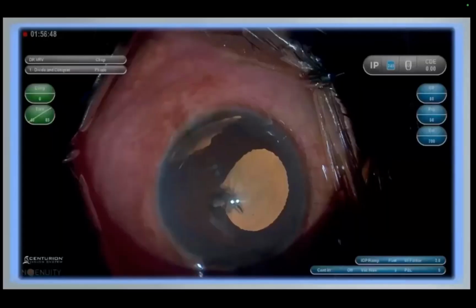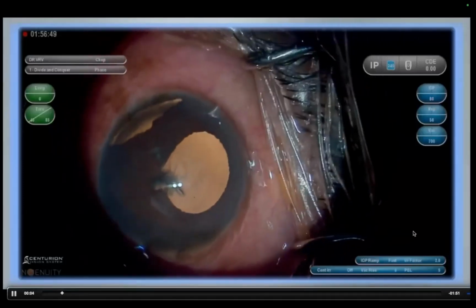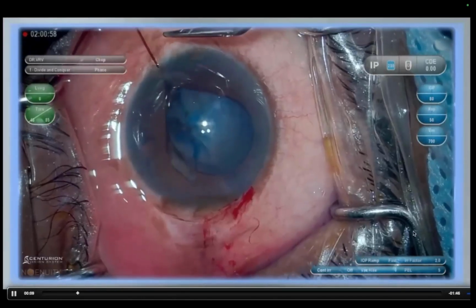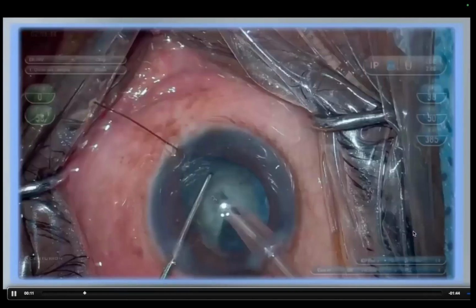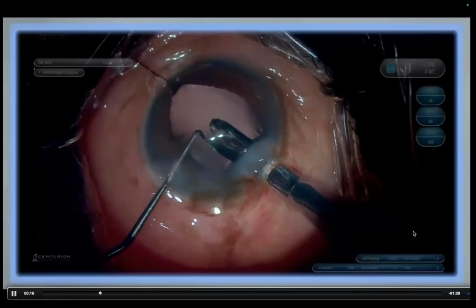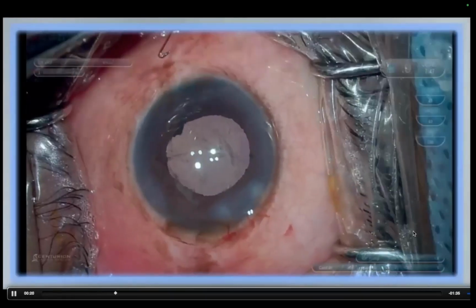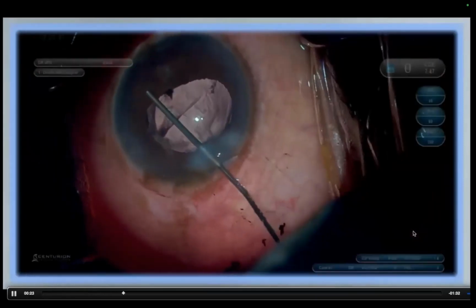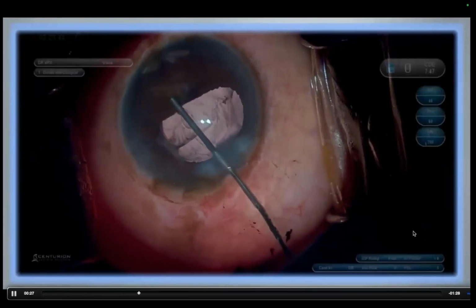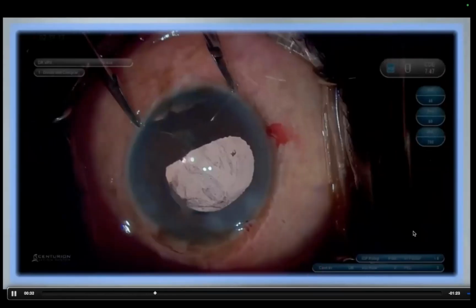Let me quickly go through this iridodialysis repair technique using the flange. It's a traumatic cataract with 4 clock hours of iridodialysis, where first you always anchor the iridodialysis and then do your phacoemulsification or your SICS, whichever is required. After placing the intraocular lens, the HPMC is washed out totally, and then I inject Viscoat or Healon5, because when you use HPMC, the iris tends to roll into a tube. When you use the high molecular weight cohesive viscoelastic, it stays flattened.